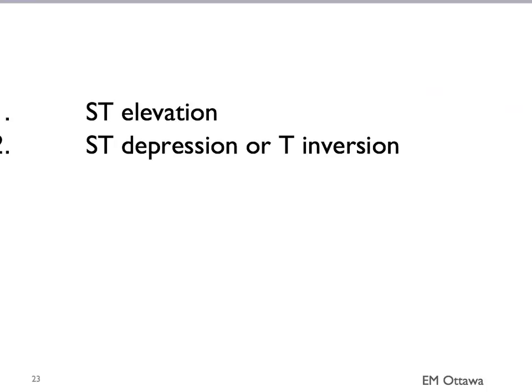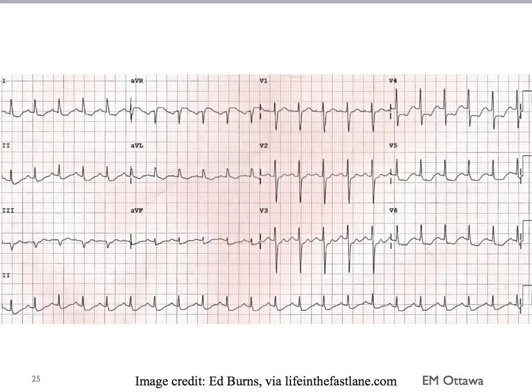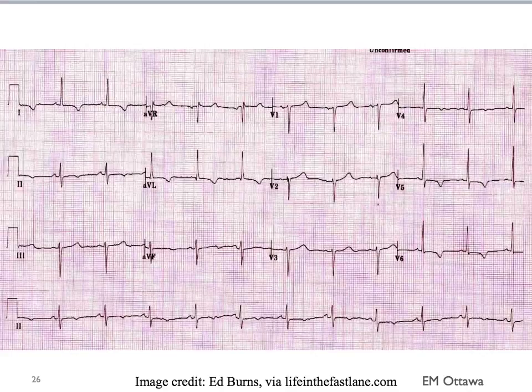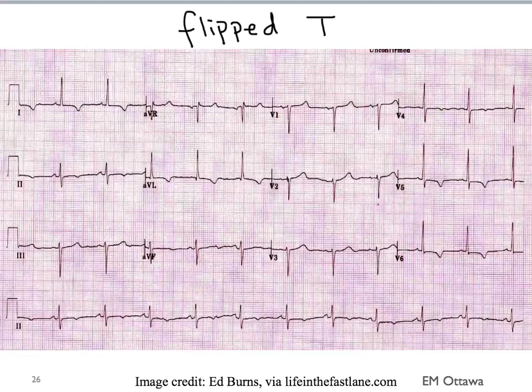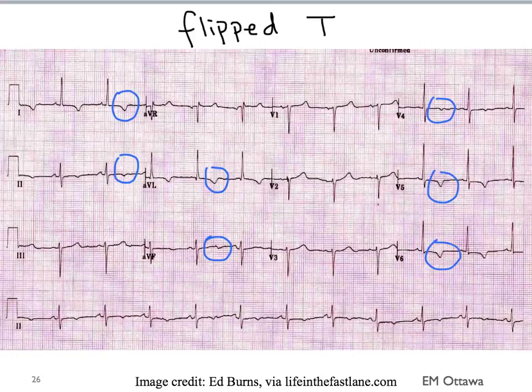After looking for ST elevation and assessing whether they are territorial or reciprocal, we then look for ST depression or T-wave inversion in patients with potential ACS. The difference with ST depression is that it denotes ischemia — it is not territorial or reciprocal like infarct. Looking at an ECG, you can see ST depressions almost everywhere, which is not territorial and not reciprocal. If there is no ST depression, we also look for T-wave inversion or flipped T's, which if new must raise concern for ischemia.